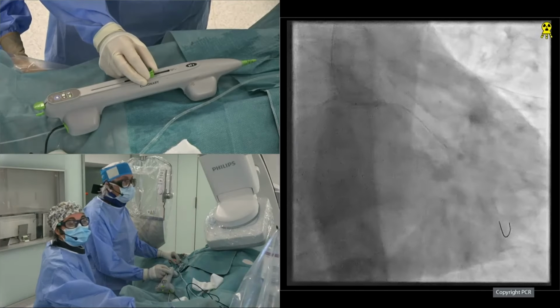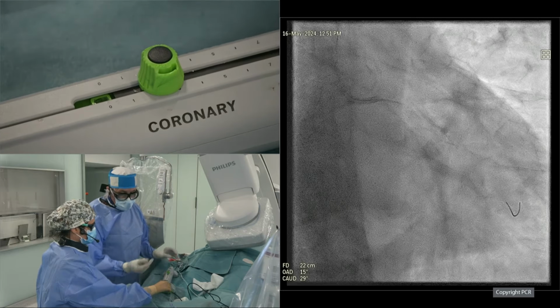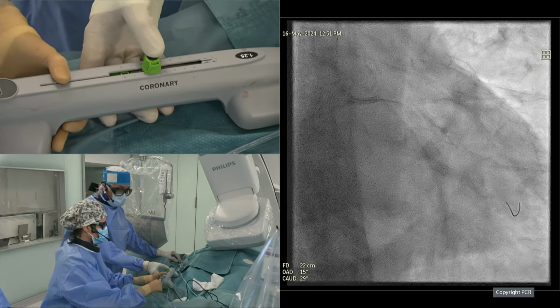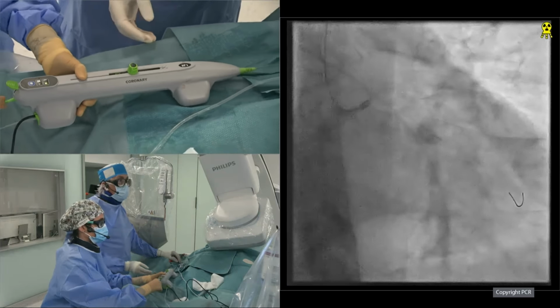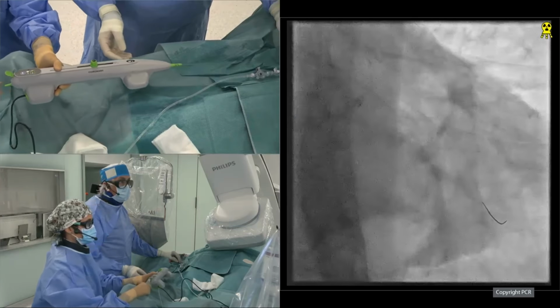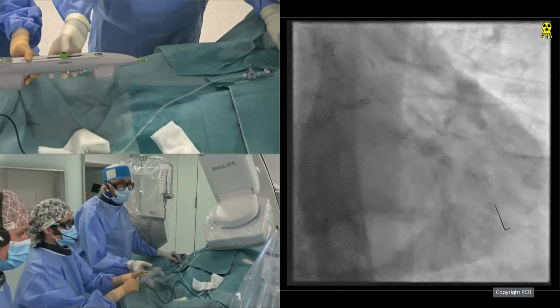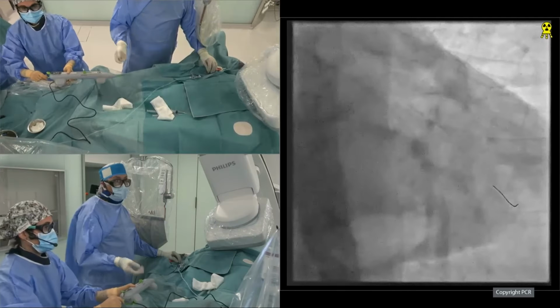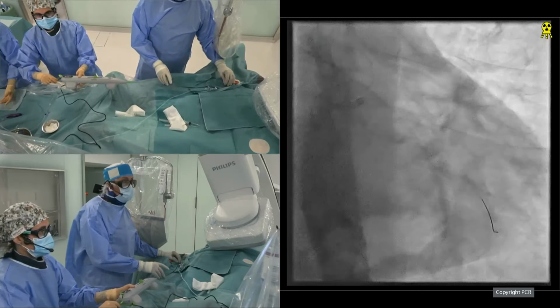Nieves, if you agree, we have completed this. We are going to put it in glide assist, at least for the initial part, and you bring it back. Now is your job. From this point, I stop glide assist because it prevents losing the wire.